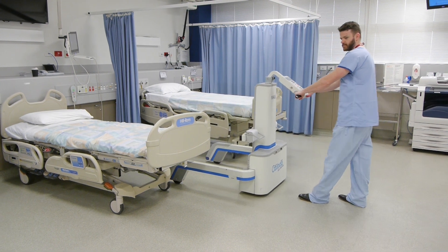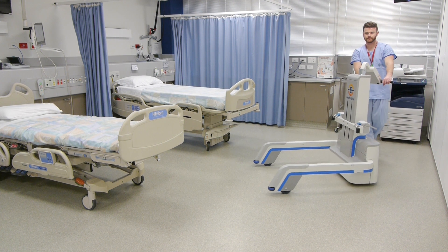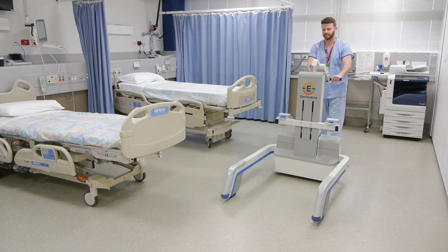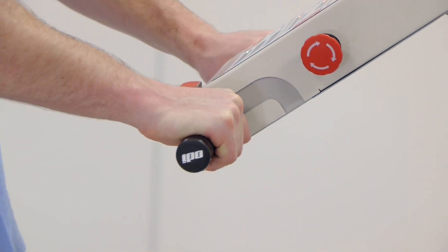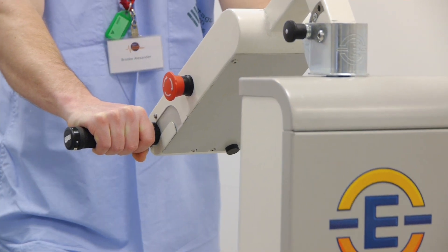Like any new machine, familiarity is the key. So the more you use the Gezunda, the easier and more natural it becomes. Now we know how to get the Gezunda moving, let's make it stop. To stop, simply release the throttle and the machine stops by itself. To get going again, turn the throttle and you're off.